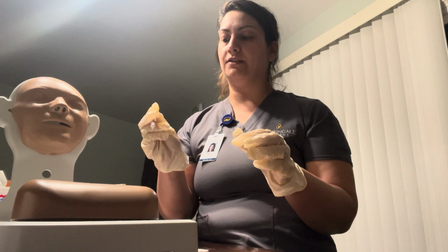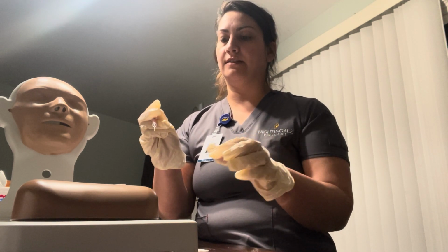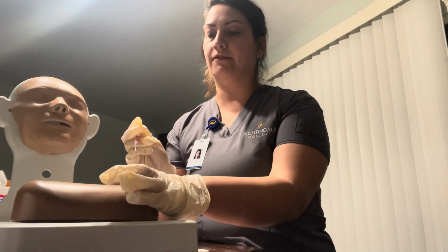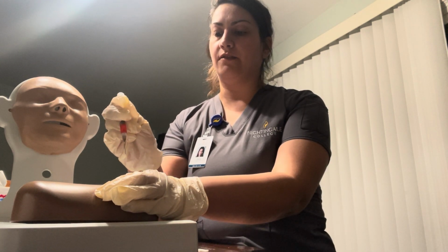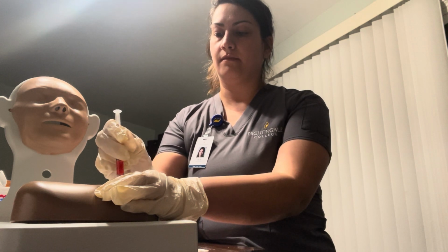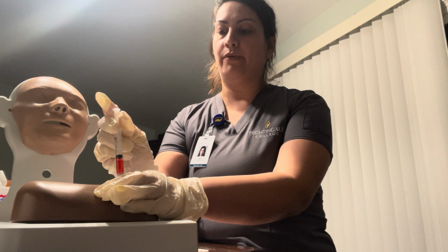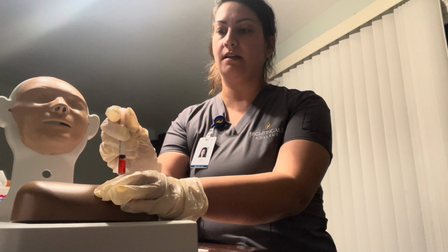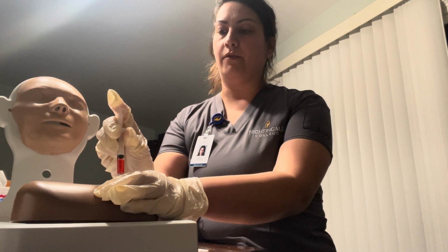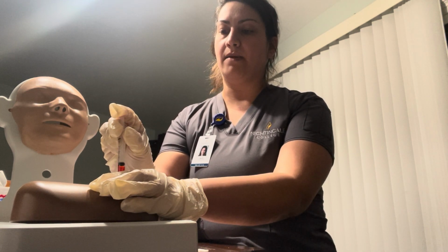we are going to make sure that our palms are down. I'm going to grab here for support. I will pull back the skin. I will go in at 90 degrees. I will pull back to make sure that there's no blood coming out, no blood return. Okay, perfect. And I will push in my medication.